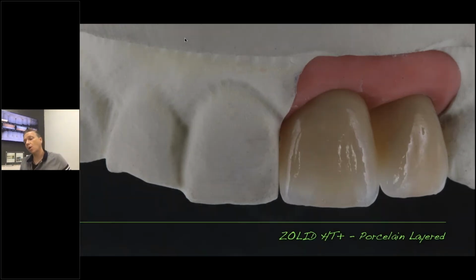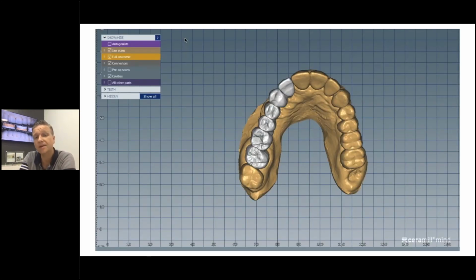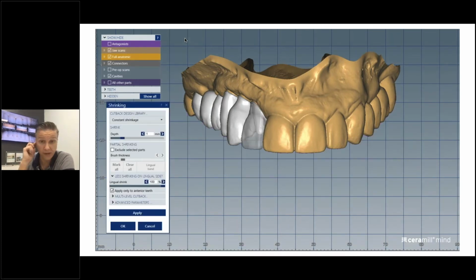So now I want to go quickly through the design process of a case like this. We have our entering screen here where we choose the restoration, anatomic crown, pontics and antagonist, and we go through the design. Here I made a full contour bridge design, and you can tell you can go pretty aggressive in the size of the restoration. That's a 6-unit zirconia bridge with pontic areas in the posterior. I have no problem doing this with that material. I always design full contour first, and go from there. Then I start looking at the case and cutting back the areas where I would like to layer porcelain.